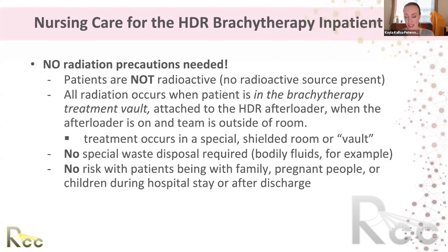These are HDR patients. LDR patients, which again, focus of this is HDR, LDR patients do have some radiation precautions, and that will vary by institution and radiation safety officers. For HDR brachytherapy, there are no radiation precautions once the treatment is done. All radiation actually occurs when they are in the treatment vault, attached to the machine with the machine on and all of us outside of the room. That is when they're being treated. And as soon as that machine turns off and the source goes back into the machine, all radiation is gone.